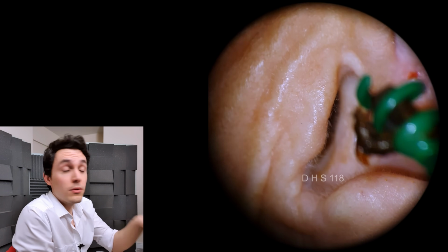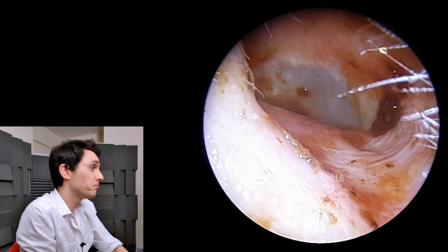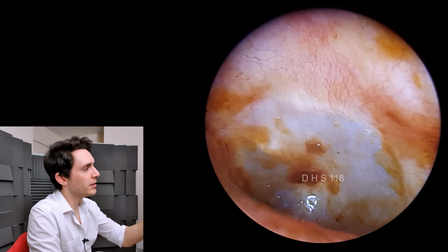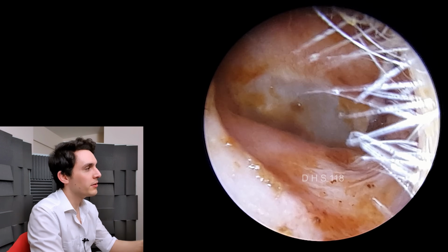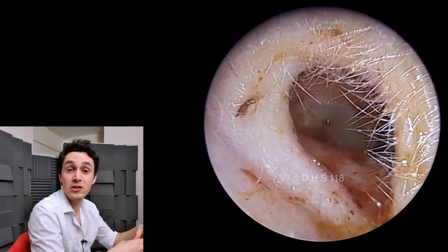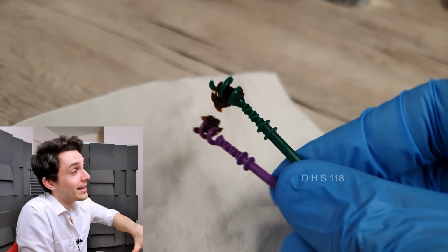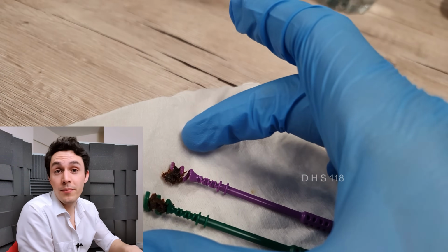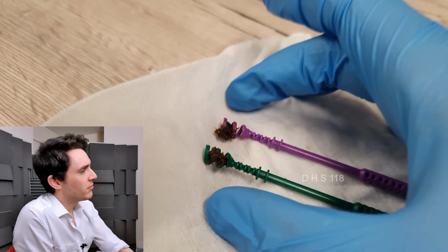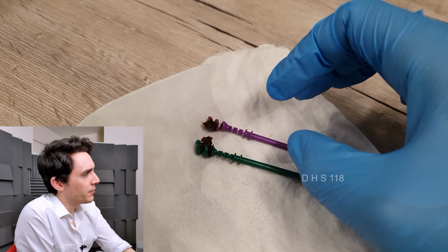Then we're going to go in and just check everything with an endoscope. So here we have it, a lovely looking ear canal, no bleeding, no laceration, no hematoma, a lovely looking eardrum, and it doesn't look pretty in the traditional sense because there's smearings of wax everywhere, but that's actually what we want. We want that remaining slick in there to safeguard the patient against itching and infection and so on.